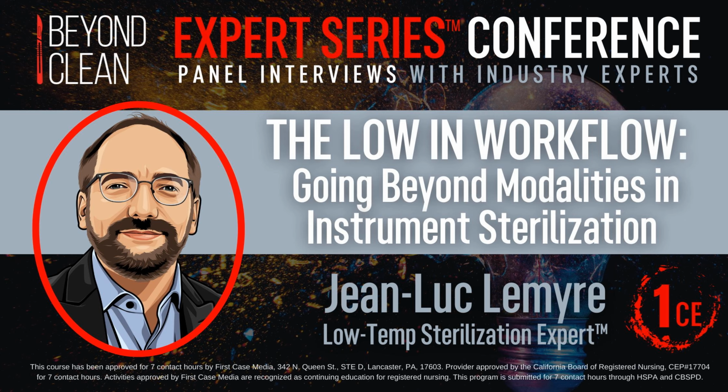If I start with cleaning, a potential for failure in sterilization is interaction between the sterilant and residual chemical from the cleaning process left on the device. So it's very important for end users to make sure that they follow the cleaning agent or the washer IFU for the proper dosage, right rinsing condition, temperature. Checking water quality also is of crucial importance.